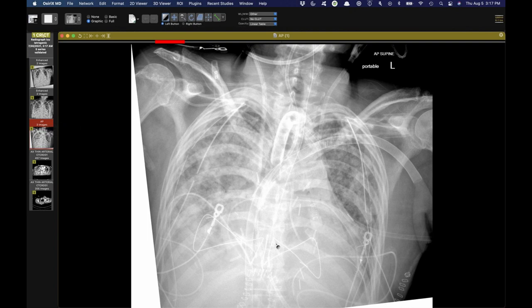They've had a recent lung transplant, as you can see, and they have issues with the lungs, but they have the typical chest tubes, they've been trached at this point because they were trached before their lung transplant. Large bore ECMO catheters. And I would admit that this would be easy to overlook, especially if you're just going through a busy, big stack of films and didn't have the history. But the history here was right subclavian catheter placement.